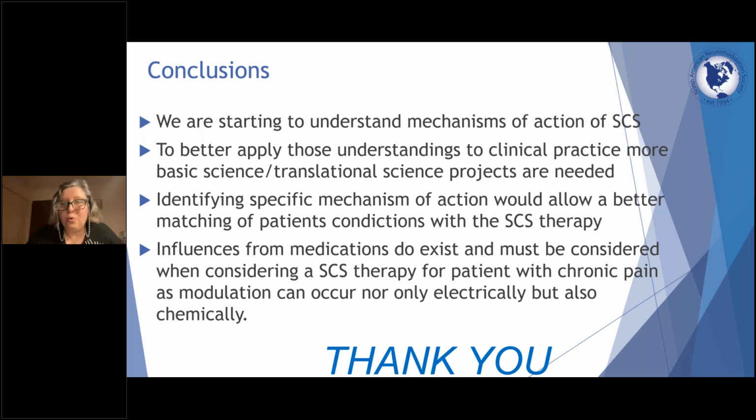So in conclusion, we briefly touched on those 3 mechanisms of action: high frequency, activation of the glial cells, and ECAP. Those mechanisms of action are still under development. They're not completely elucidated.